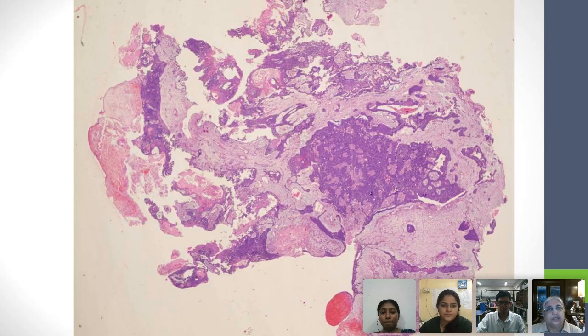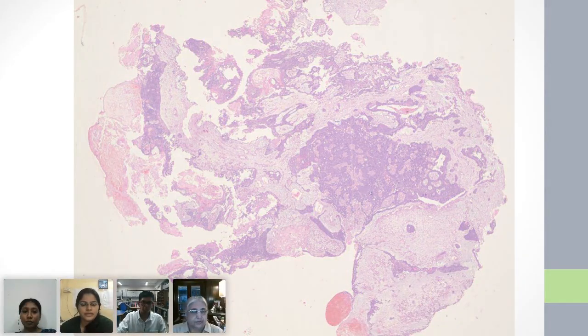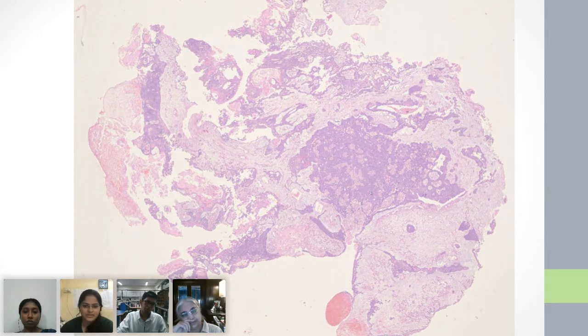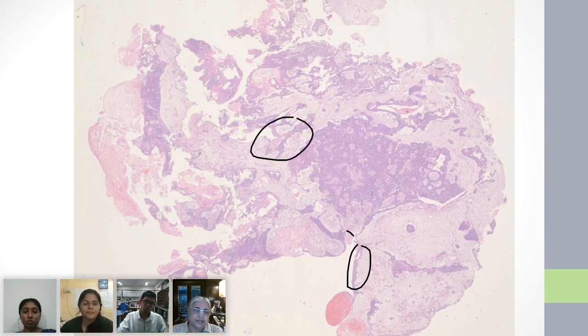Yes, come on now. Come on, Kshitija, you have to describe this. Yes, ma'am. This is a biopsy bit from the mass which was there in the oroantral fistula. According to the five questions which we learned last time, is the normal epithelium seen? So I think the normal epithelium is seen in these areas. Here and here, the normal epithelium is seen, and the rest of the tissue is abnormal.